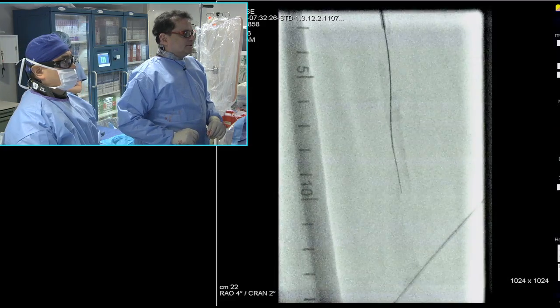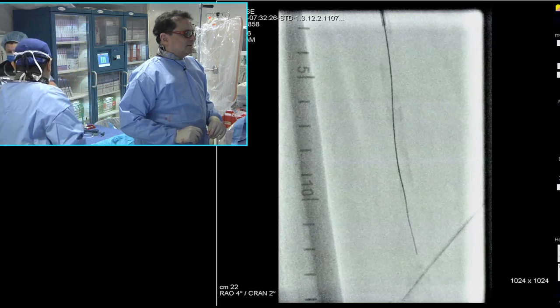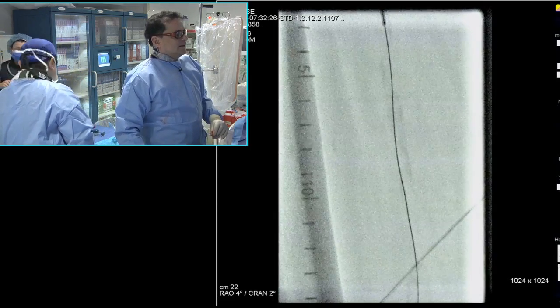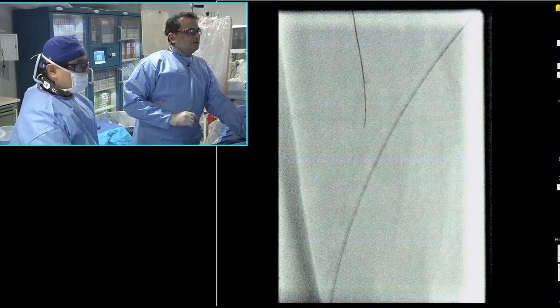See, right there, it seems to be doing some crazy things. Right. It just deviates off the path. I think that's the occlusive part right here. There. That sounds a lot better now. Ray, give me a little DSA here. I mean, or just a picture. Ready, regular picture, inject.